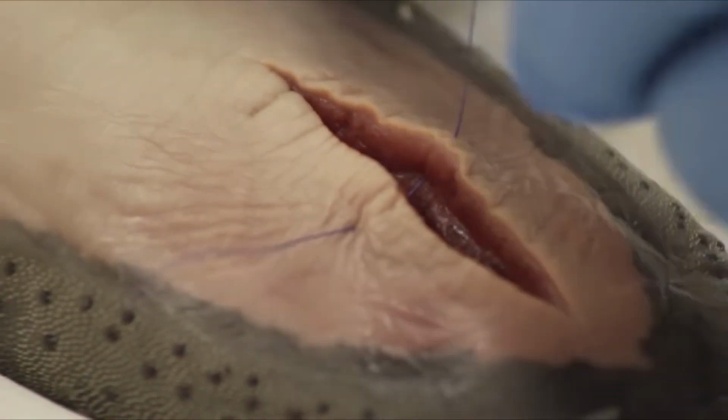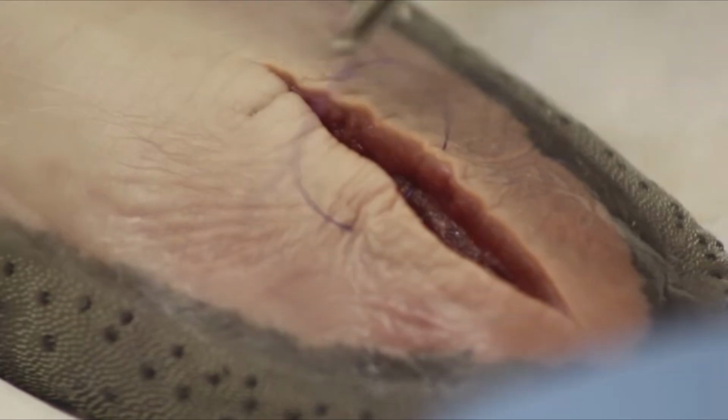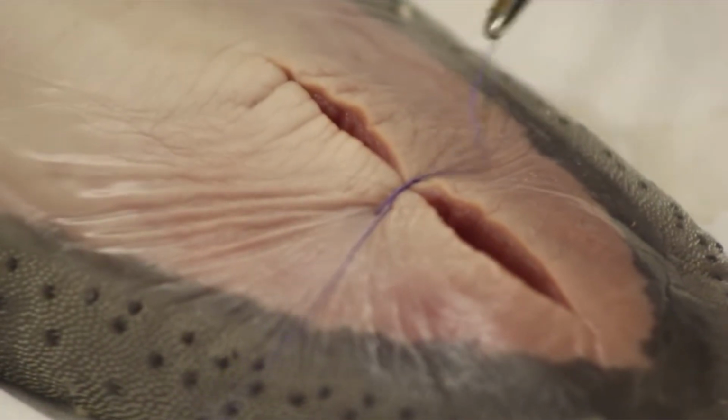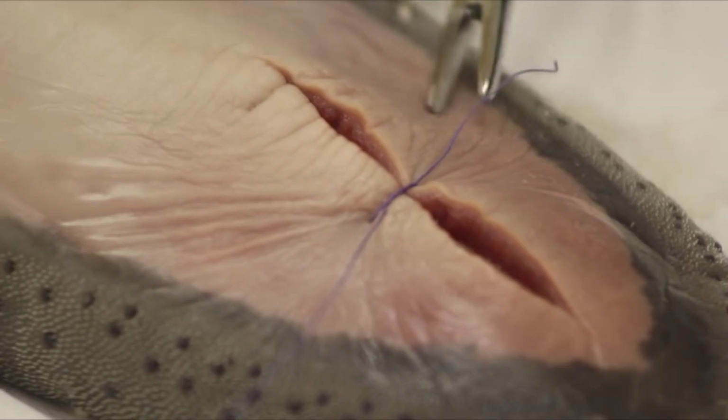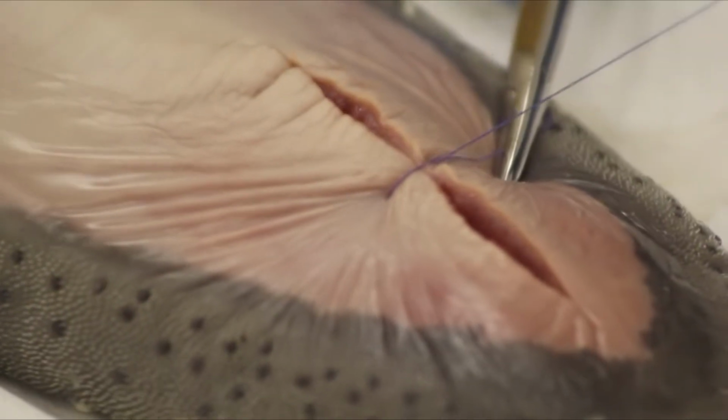Pull the suture through, leaving a short tail for tying. For the first throw, wrap twice for a surgeon's knot, so the knot does not slip while tension is set. Tighten just enough to approximate. Avoid strangulation. The tissue should come together, not pucker or blanch.